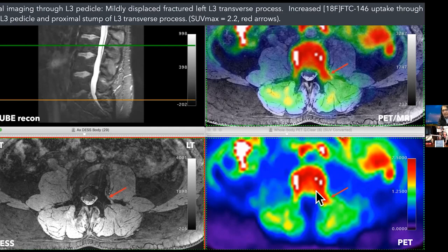And then here's the PET image, and the uptake is going all the way up to the fracture margin compared to the other side. So a little trick with this tracer, there are some normal physiologic areas which do take up the tracer. We're still trying to understand that. As you can see, there's some bowel uptake. It doesn't mean he has bowel pain. It just means there's some areas in the body which normally express a higher level of Sigma-1 receptor. The marrow in the vertebral bodies is also another area, but it does so at a relatively intermediate level. So these brighter areas may also be potential pain generators, but we still don't quite understand. We're going to need to get some funding to do a big clinical trial to better understand it.